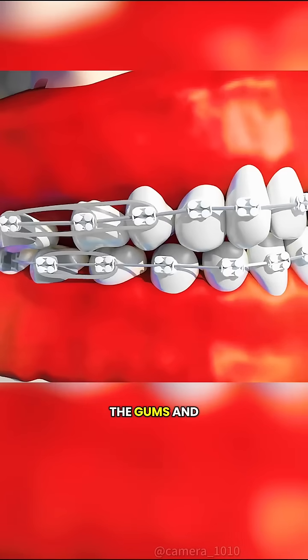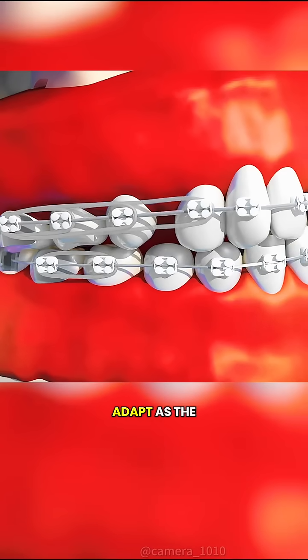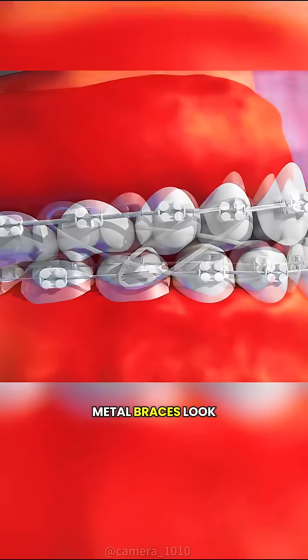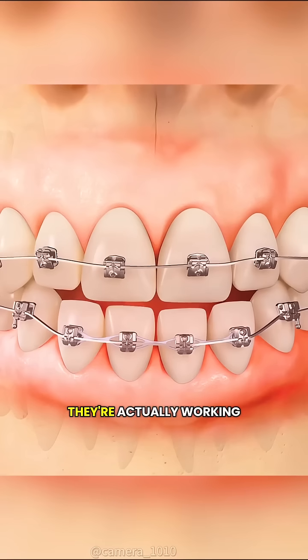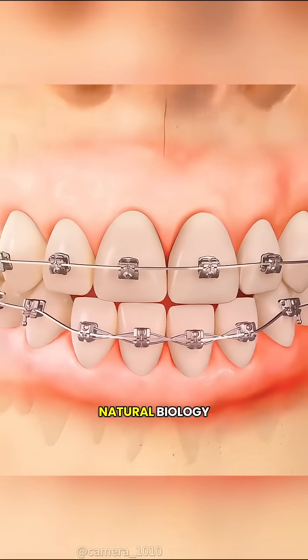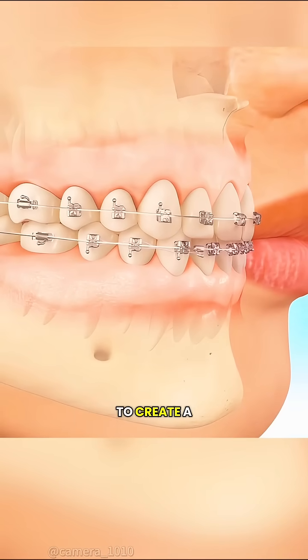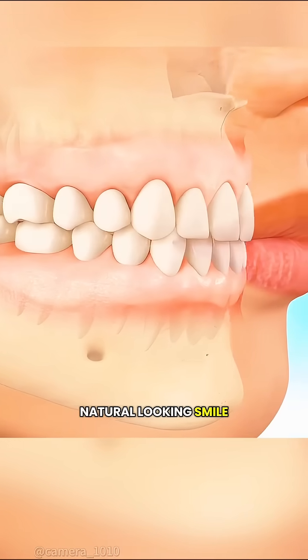Meanwhile, the gums and the periodontal ligaments adapt as the teeth shift, helping the new alignment become more stable. So even though metal braces look simple on the outside, they're actually working with your body's natural biology, reshaping bone and adjusting nearby tissues to create a straight, natural-looking smile over time.